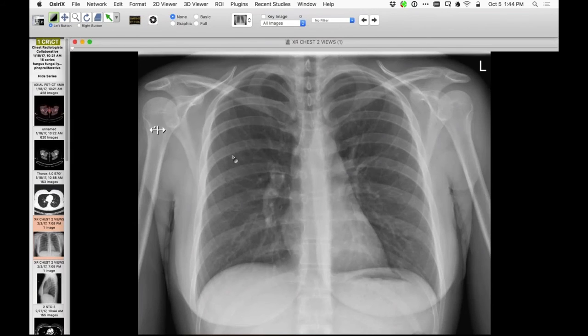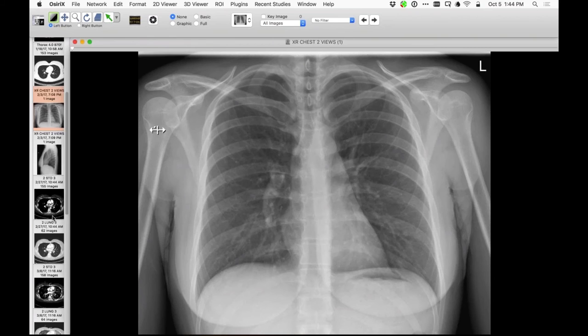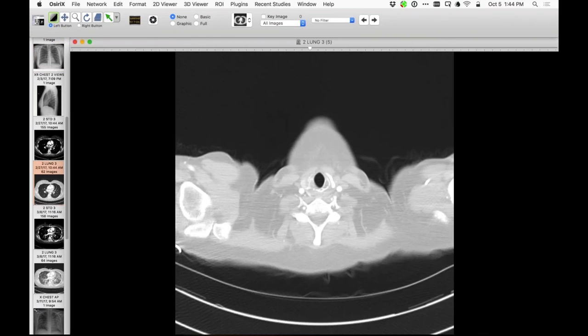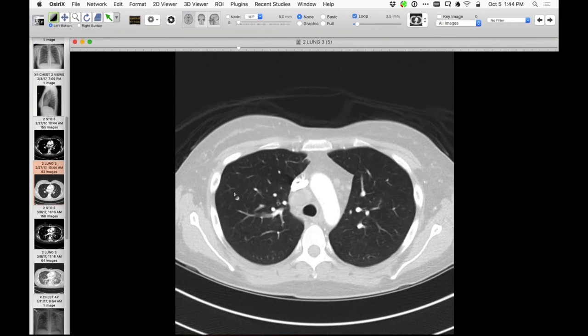This is a patient, I'll give you some more history in a moment, that at this time was looking okay, at least in the chest. Back in January of this year, she had apparently soft tissue masses on an extremity and received a diagnosis of a lymphoma. It presented in that fashion. She was treated with a regimen for lymphoma around that time. I think this is maybe the time when the lymphoma was diagnosed, when her chest looked okay.